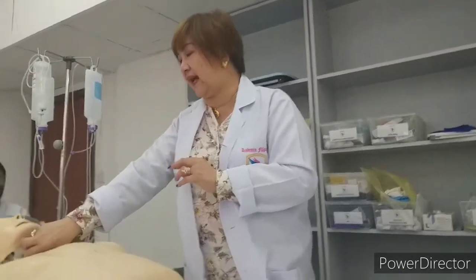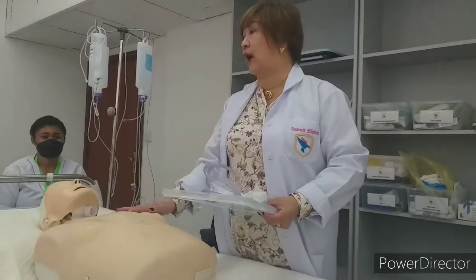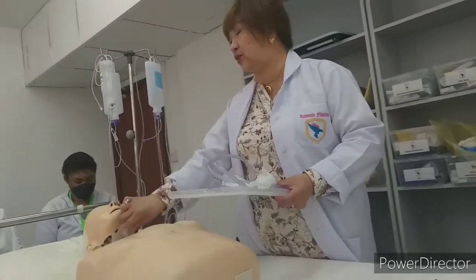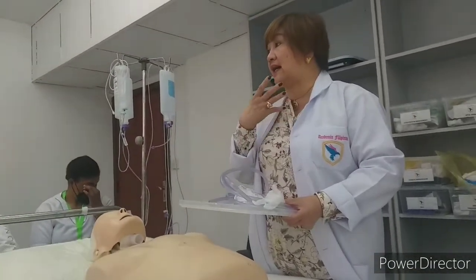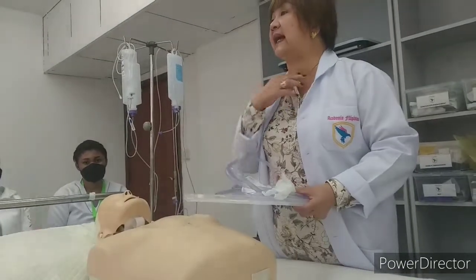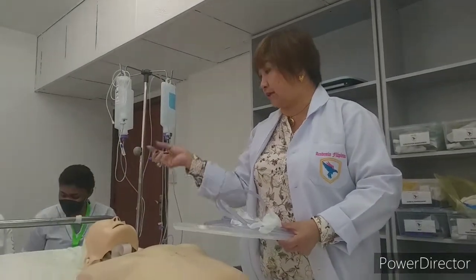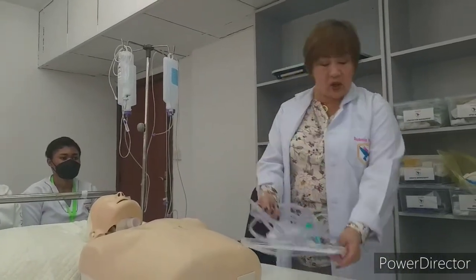Oxygen administration and suctioning. So, suctioning. For all of those of you who have done the tracheostomy, this is the continuation. Once you do your tracheostomy care, these patients will start to have secretions, and secretions will accumulate down in the tracheostomy, the pipe within the trachea. So once we see the patient requiring suctioning, we need to do it soon.